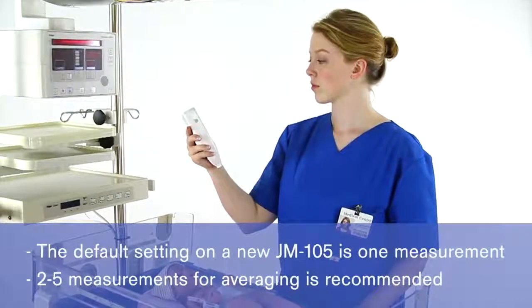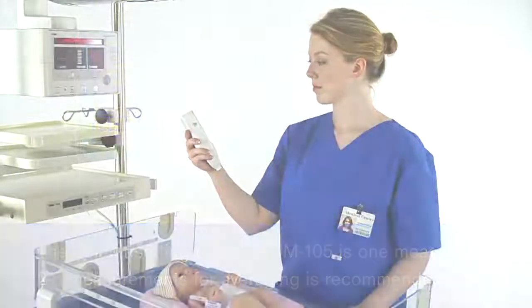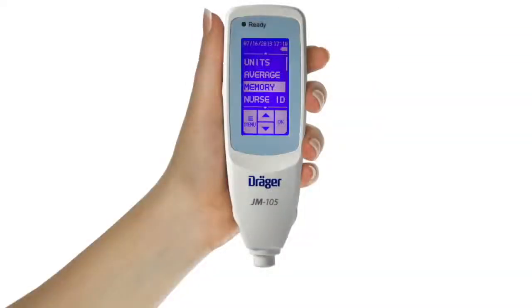The default setting on a new JM105 is for a single measurement. It is recommended that between 2 and 5 measurements be selected for averaging to get a more accurate reading. The next feature is Memory, which provides 3 options.